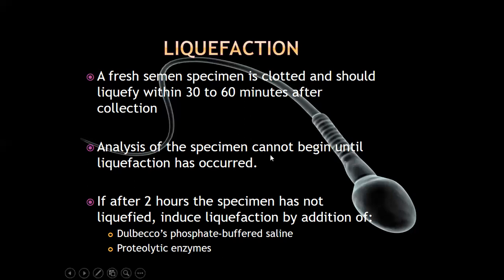Analysis of the specimen cannot begin until liquefaction has occurred. Why? Because the coagulum would impede sperm motility, so it will be difficult for you to assess other parameters.